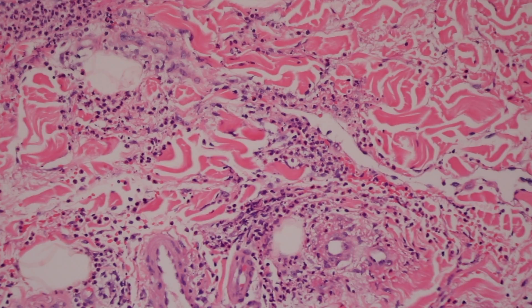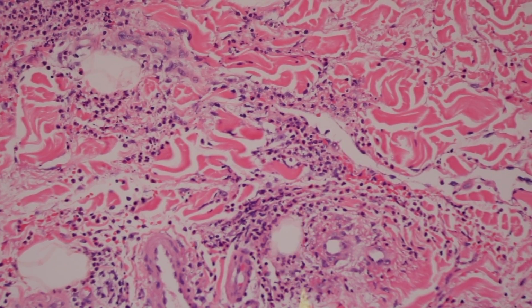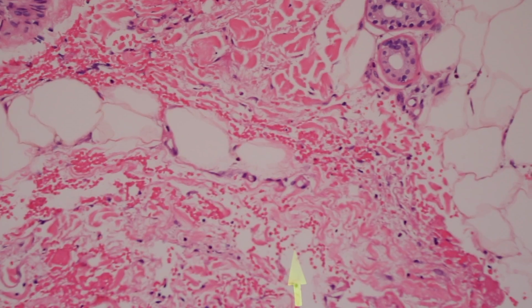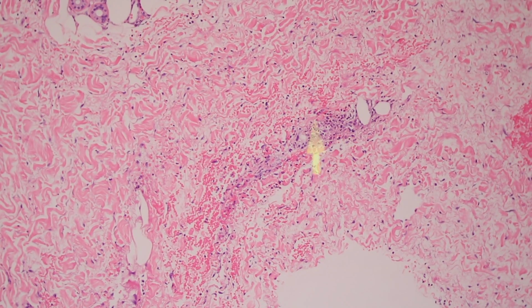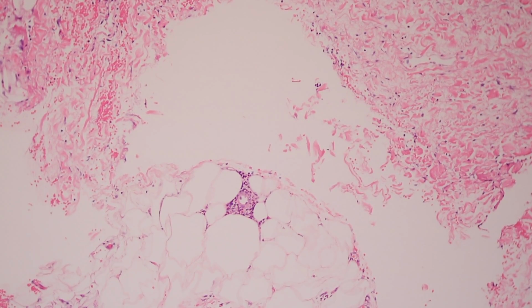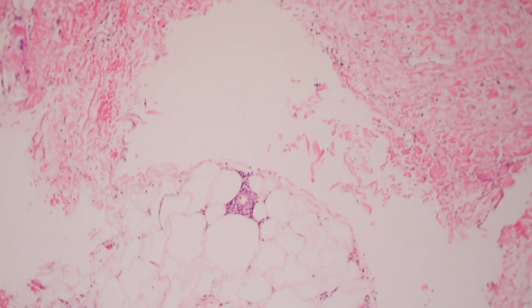But we have also, when we go down deep, we can see that deeper vessels are involved too. And this vessel is relatively normal, but the small vessels around it have some damage. And it's going all the way down, even down here. So deep dermal vessels, and even in the subcutis we can see that vessels have neutrophils around them. So that's one sign for systemic disease.